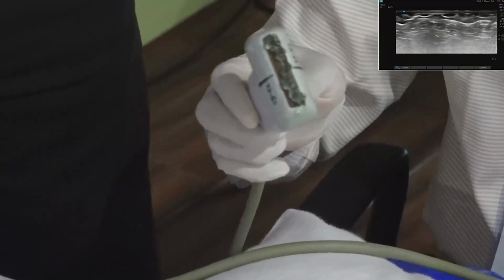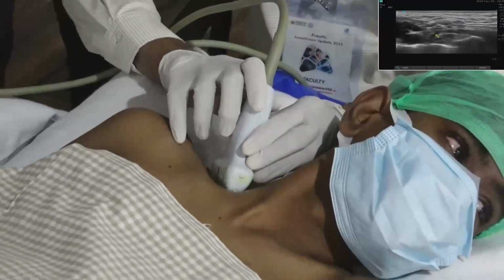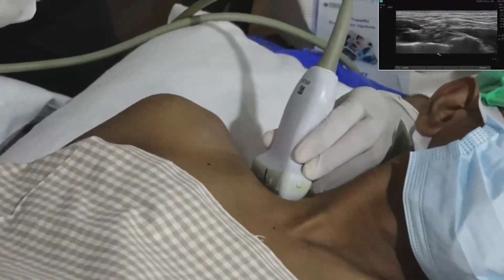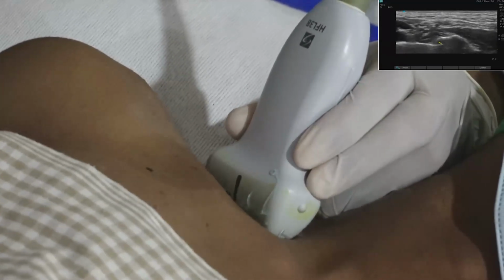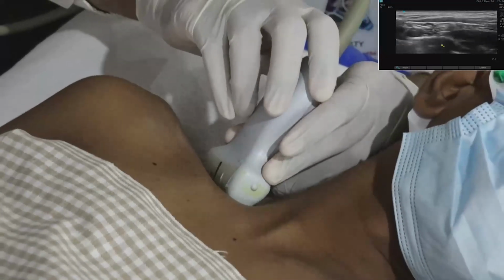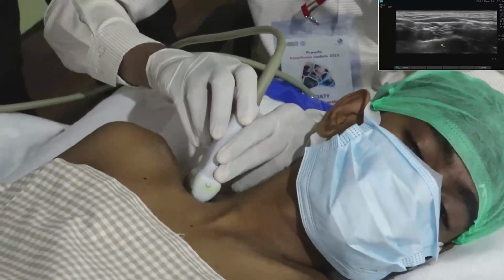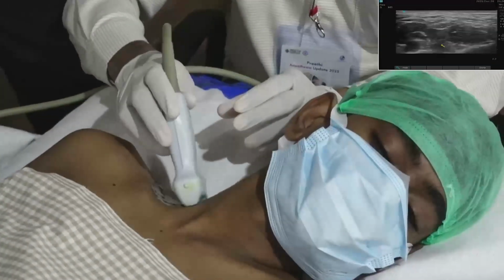Even this positioning, I have kept the pillow a little below the shoulder. That is also more important. Identifying the pleura is also very important. If you are tilting the probe a little, the pleura is there next to the first rib. So easily when we handle our needle, it can come and touch the pleura. So we have to identify the pleura. Either you can avoid the pleura by keeping the probe like this, or you have to move away and give the block.